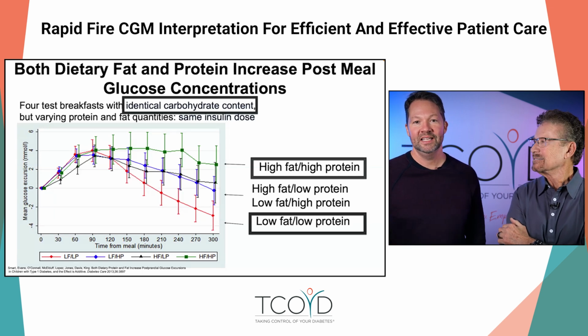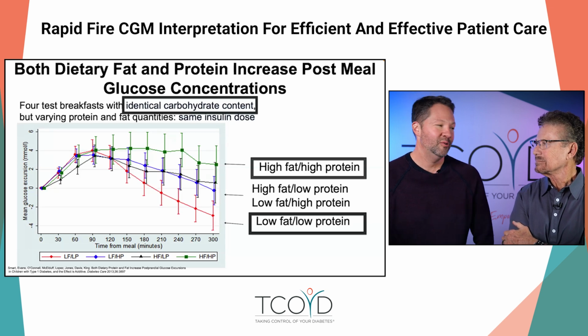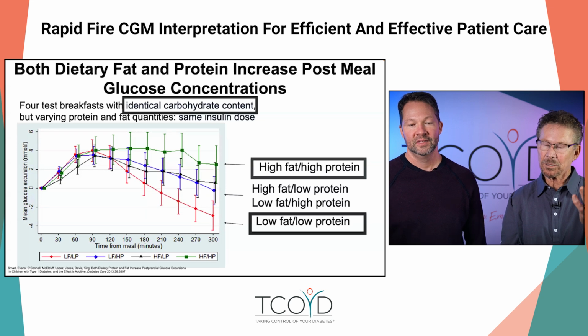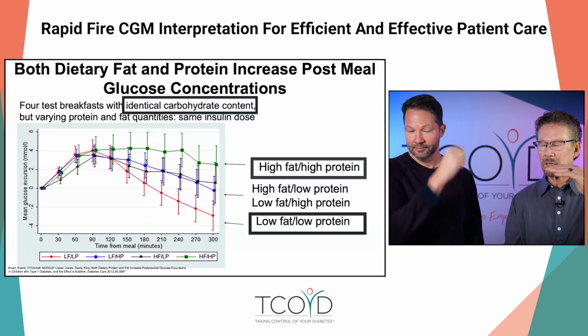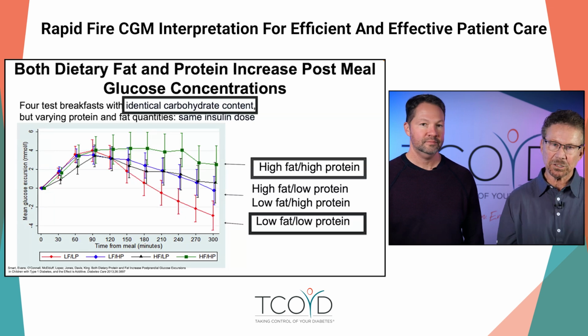But the idea here is that even if you get your carb counting right, you have to account for the protein and fat, which is no real great formula for, just more insulin, more little touches. And to keep an eye on your blood sugar. And that's why my upper alert is set at 150. So if it is going to creep up later on, I catch it early.